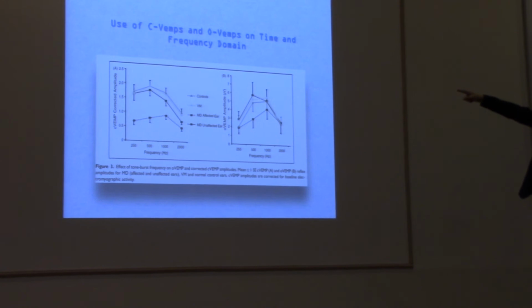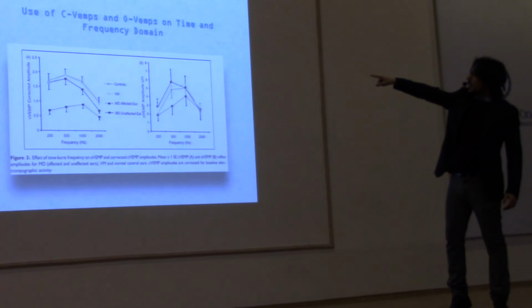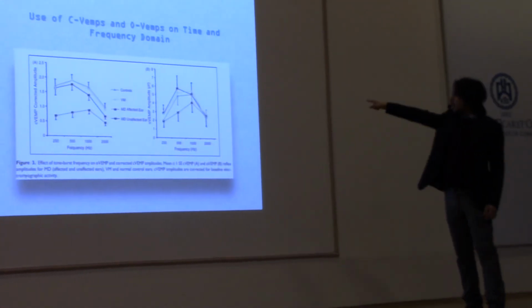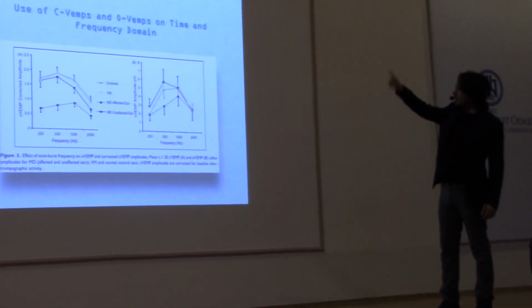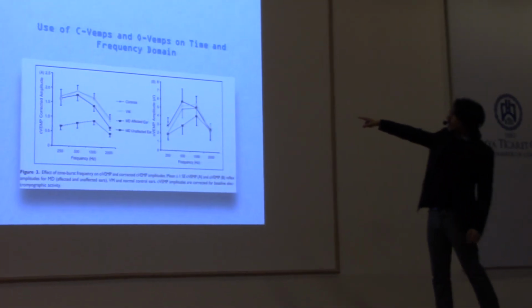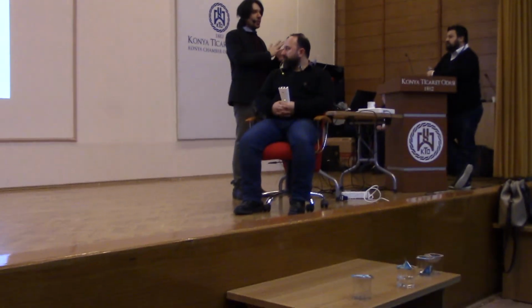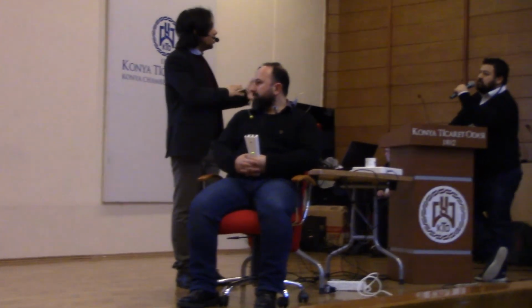You have vestibular migraine on the triangles, the gray one, and controls, the normal one, is the first. Here the same: the squares are unaffected, the continuous line, and the other one shows a tuning shift. Interestingly, Meniere disease is quite selective for the tuning shift phenomenon, while in vestibular migraine you can have both results, even a normal tuning.